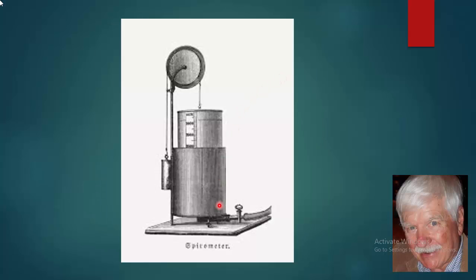Here's the kind that we've used for years in the Lenore Ryan Anatomy and Physiology Laboratory. It's kind of archaic, you can tell, but it works. You put water in the drum, and then this is a cylinder, and when you blow in, see, they don't show you this, but see this little tube coming into the bottom?